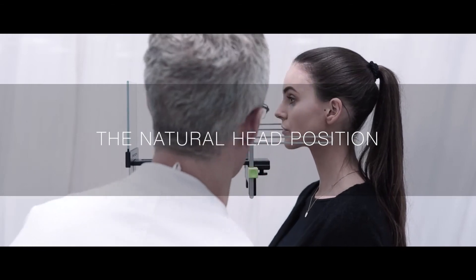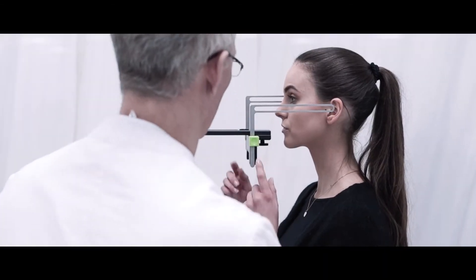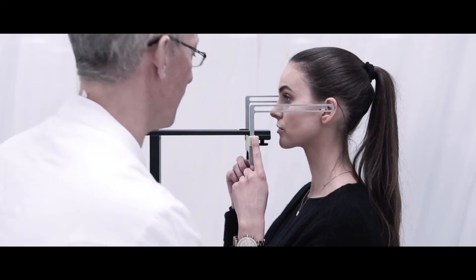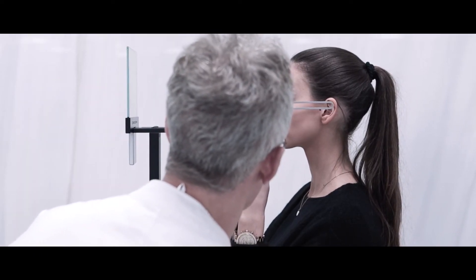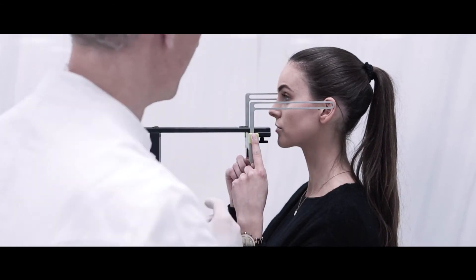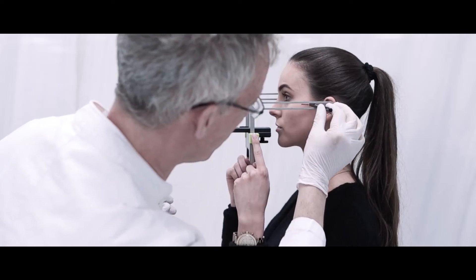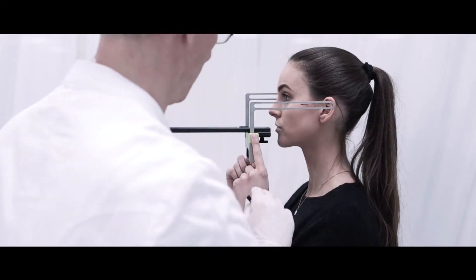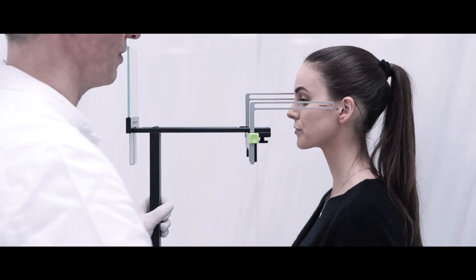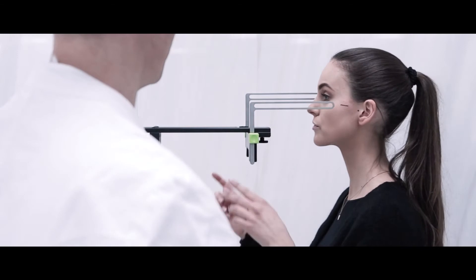After the first phase of facial scans, the dentist uses the plane finder to detect the natural head position in the natural plane. He asks the patient to stand in front of the plane finder for the final adjustments before acquiring the scans. Several recordings are made, and in order to verify that the natural head position is always kept, the dentist marks a guideline on the patient's face at the level of the bar parallel to plane zero.